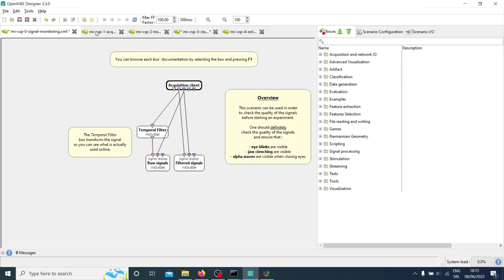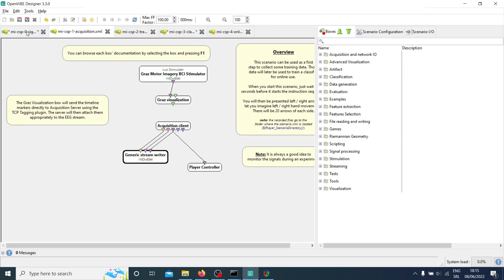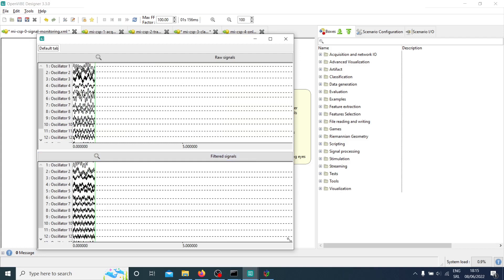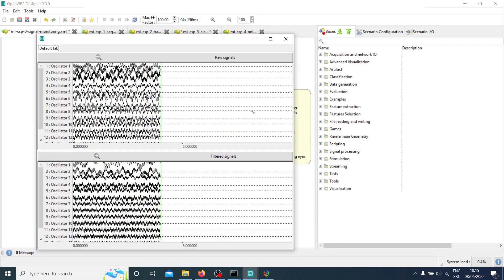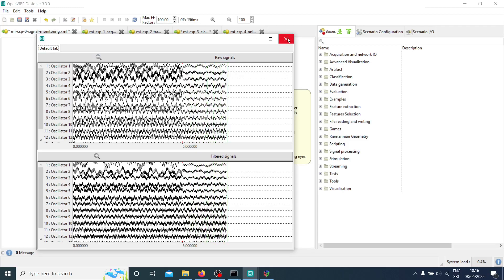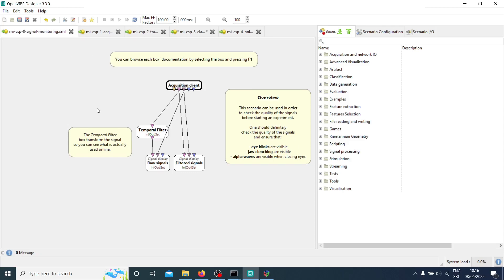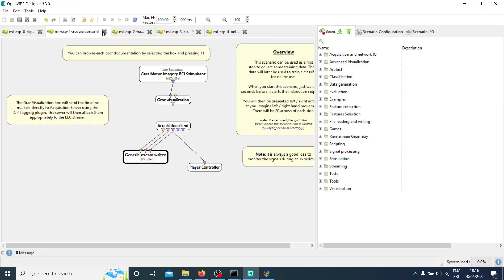Before the next scenario, it's really recommended to check the signal and see how it looks. You ask your participants to blink or clench their jaw, and you check if the alpha waves are visible — for example, tell them to close their eyes and you should see alpha waves appear. Right now we only have fake signals, 14 channels, so it's nothing really meaningful. This is just for the example so you can see how it looks.